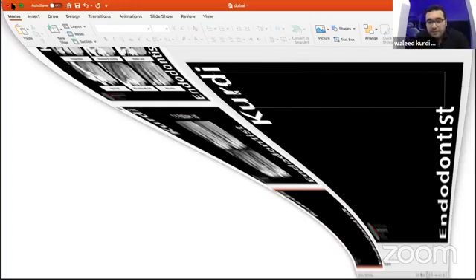Imad Albert, types of ultrasonic tips and the best in your opinion, some tricks about it. All right. About the UltraX ultrasonic tips, we have 3 tips. We have the gold one, silver one, and blue one. The gold one is very, very good in retrieval and also in dealing with such ledge cases if you want to correct it.